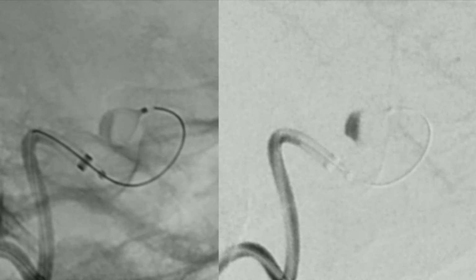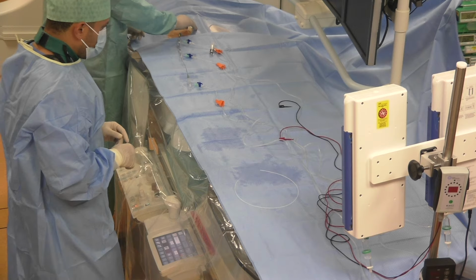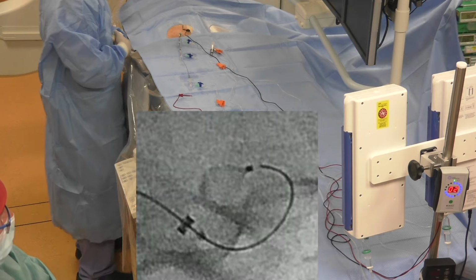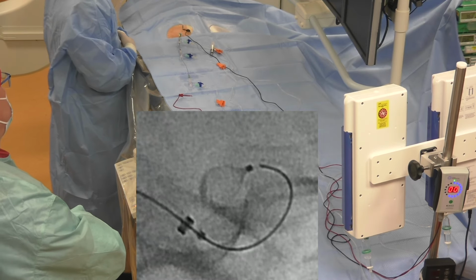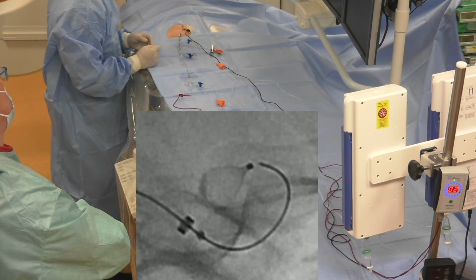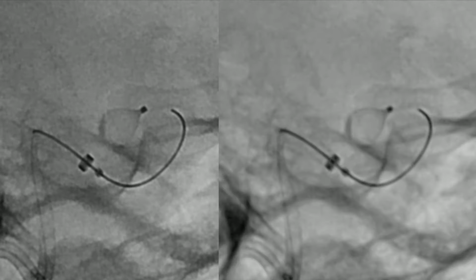And we can see already the blood stasis in the aneurysm sac. And now we will detach the contour device, the black cable to the patient, the red one to the pusher of the contour device, and now we activate the detachment device. Sometimes we need more than one time to detach the pusher, and as you can see, it's now detached.